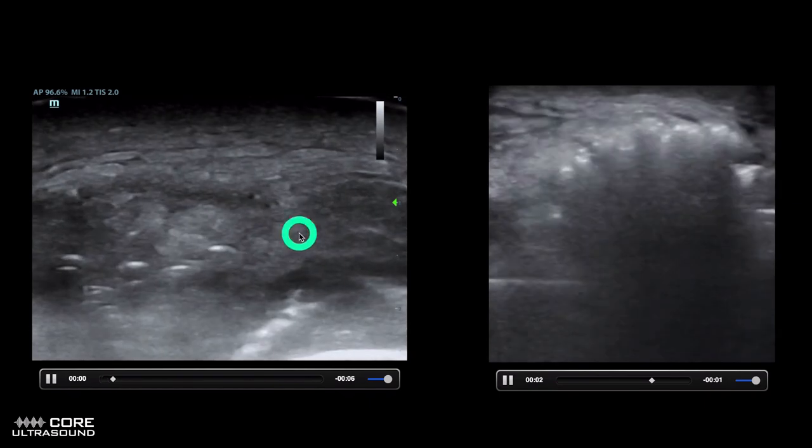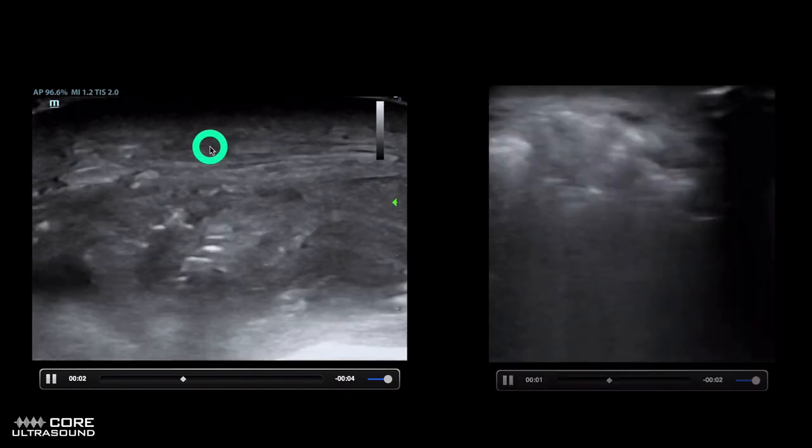So this is just chronic edema. The key difference is looking for the shadowing — shadowing's a big deal.